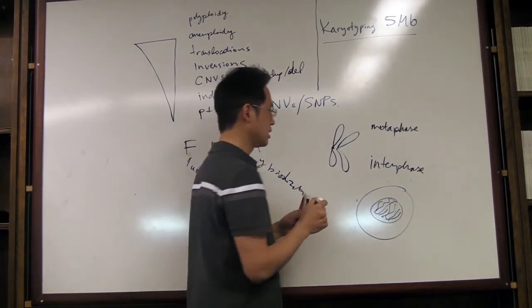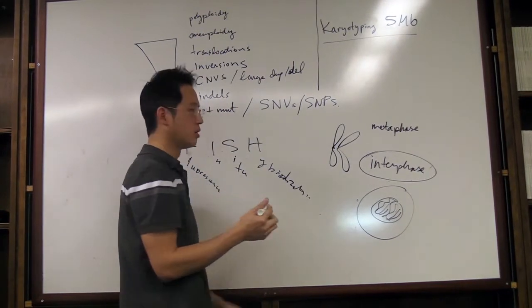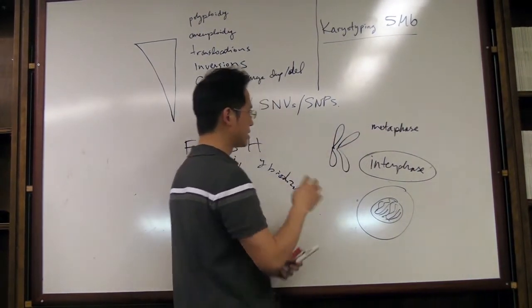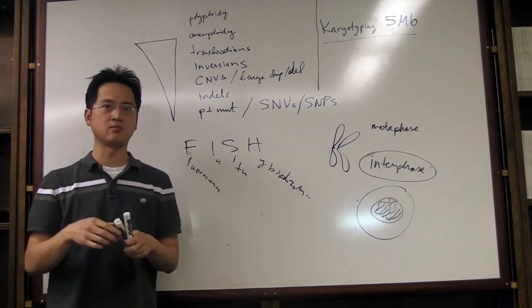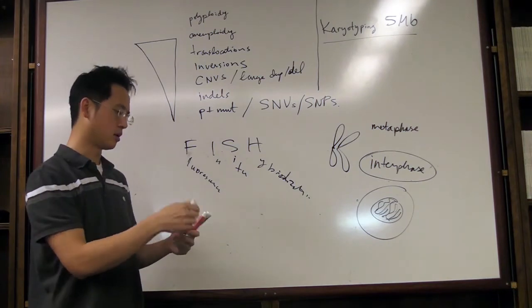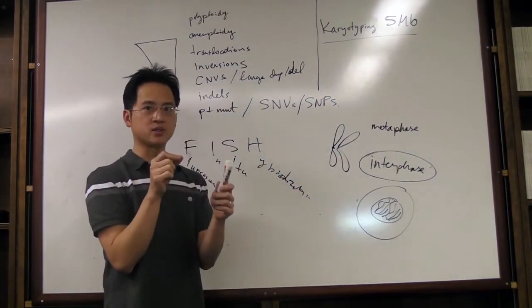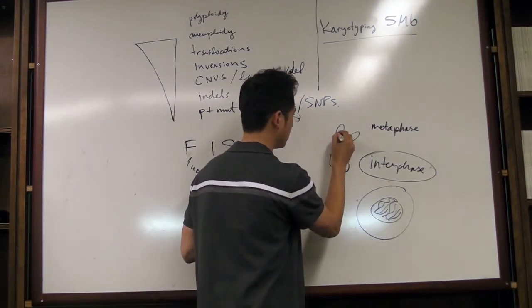So we deal mostly exclusively with Interphase FISH. The way it looks is going to be different. So on Metaphase FISH, instead of staining with a Giemsa stain, which is a very generic stain that stains everything purple or light pink, in Metaphase FISH you're only looking for a very specific signal on a very specific chromosome. So what it'll light up with is right there.